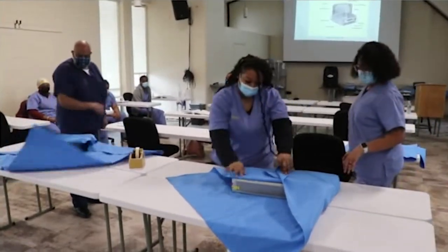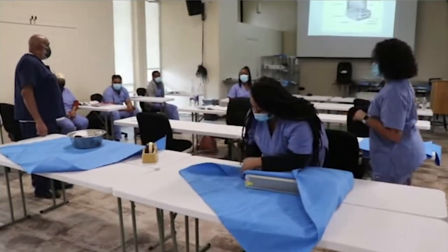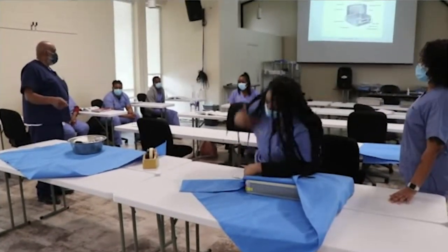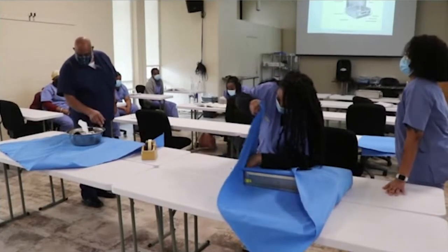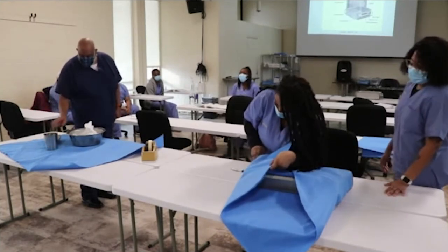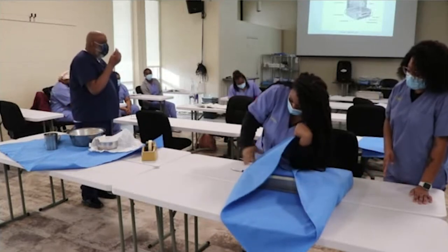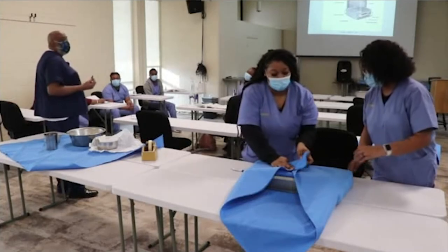So this is what they want to do when it comes in the OR. They want to open it right up. They don't want to fight with it. And what is the first thing they're looking for? The indicator, which I don't see. It's in there, like Prego. We could have used a couple. It's all in the bottle. But it was in there, and it's okay to put two.